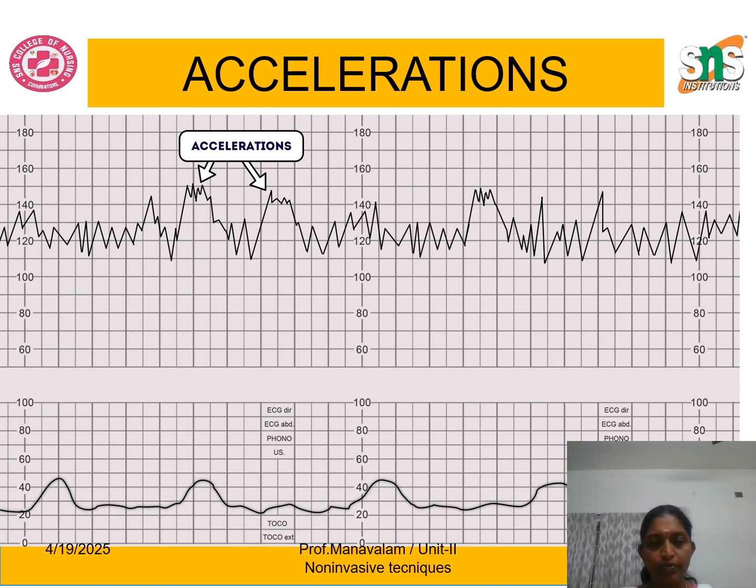Whenever there is a uterine contraction, we see an elevation of the line as the intrauterine pressure rises. It starts from 20 and ends up at 50, then comes down to a flat line. A flat line means the mother is in the resting period. Then the next contraction starts. In a 10 minute period, according to this graph, there are two uterine contractions. According to these contractions, there are changes in the fetal heart rate.